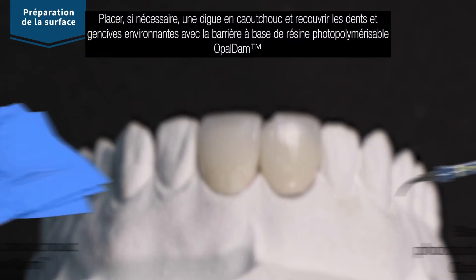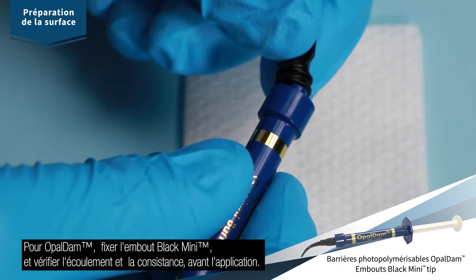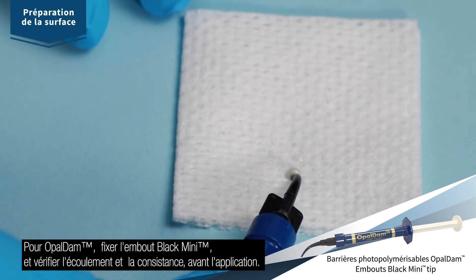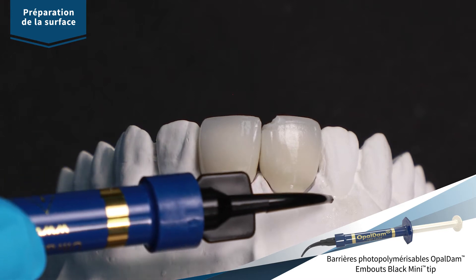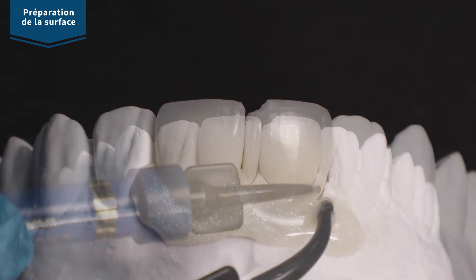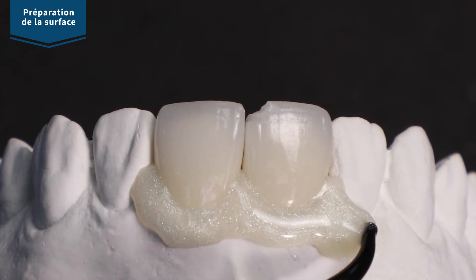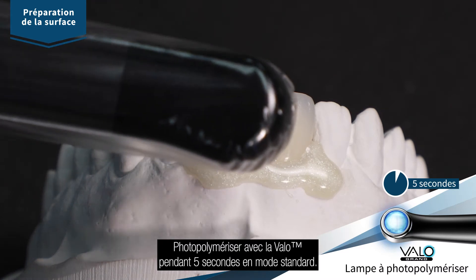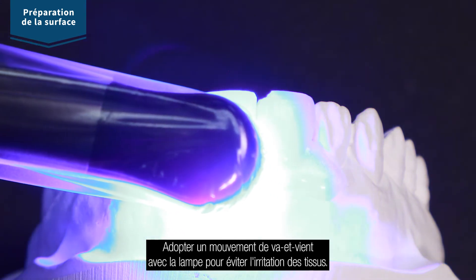Isolate adjacent tissues and restorations with a well-sealed rubber dam or opal dam resin barrier. For opal dam, attach the black mini tip and verify flow and consistency before applying. Light cure with Velo curing light for 5 seconds on standard power mode. Use a scanning motion to prevent heat irritation on the soft tissues.